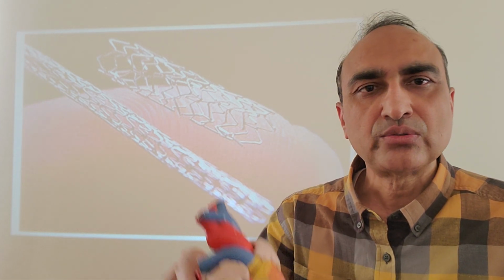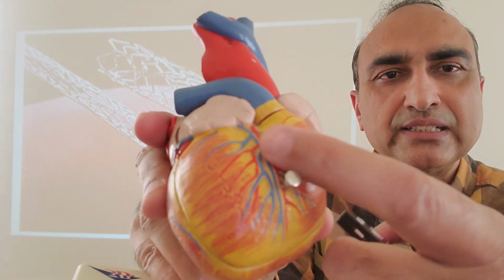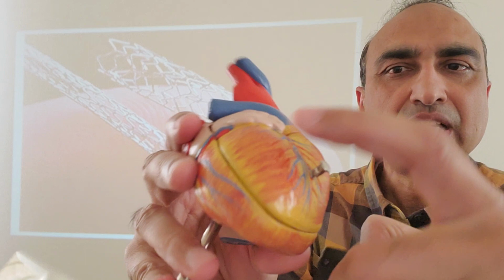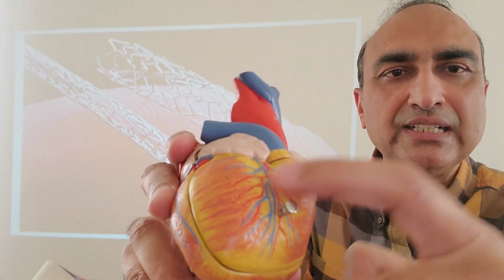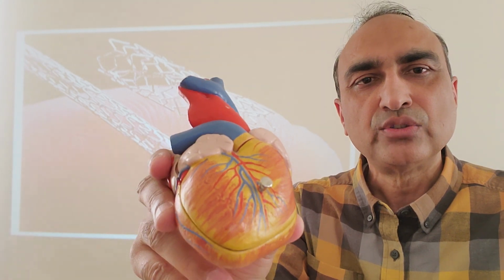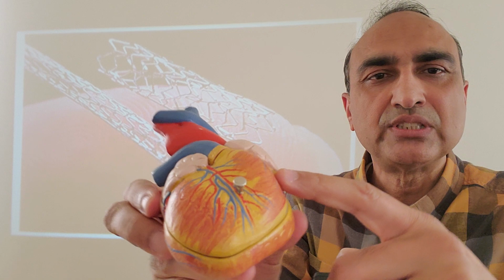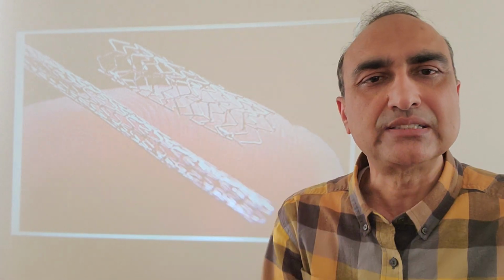Just to recap what we talked about earlier, this is how the heart looks, and these are the arteries of the heart which need coronary stenting in case of angina or a heart attack. This is the front artery, as we talked about in one of the earlier videos. This is the right artery, and then we have a back artery.